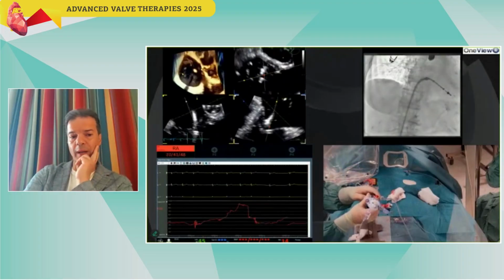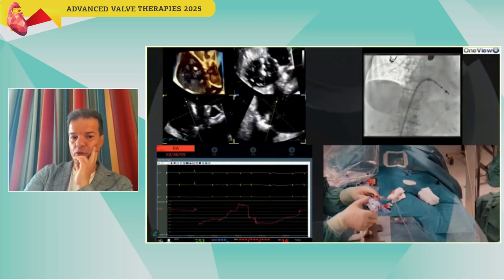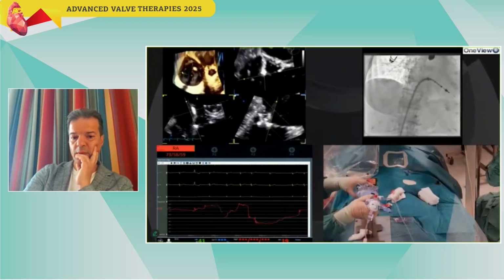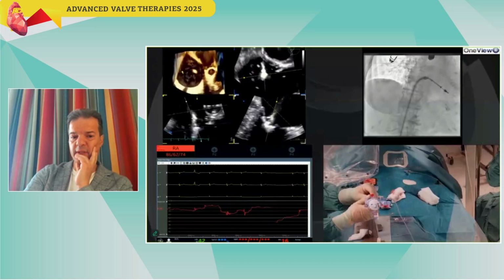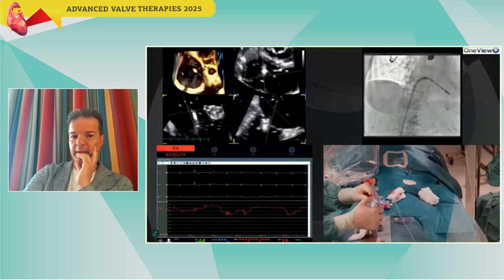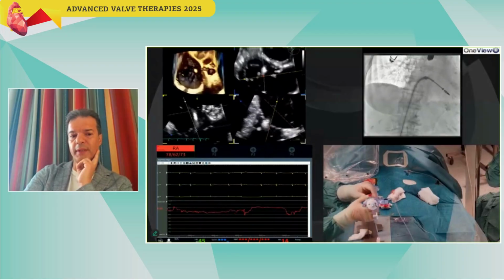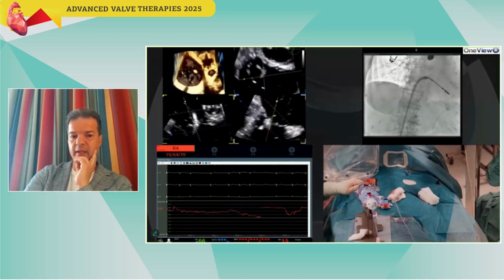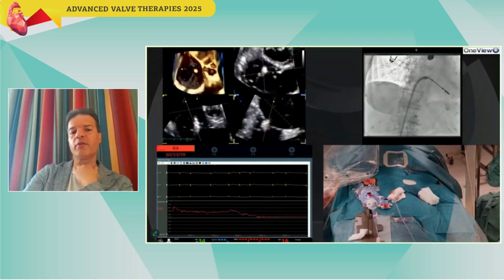So you have all in one. And now we go up and the septal leaflet is in position. And once we drop the gripper, we correct the rotation of the system, and then we lock and we close. And we try to do that first time if possible. We don't like to open and close on the tricuspid leaflets. They're thin leaflets, so by doing as little as possible, you avoid injury.